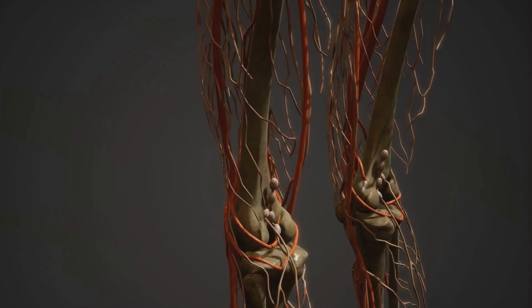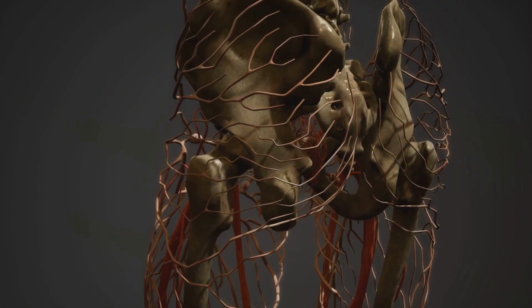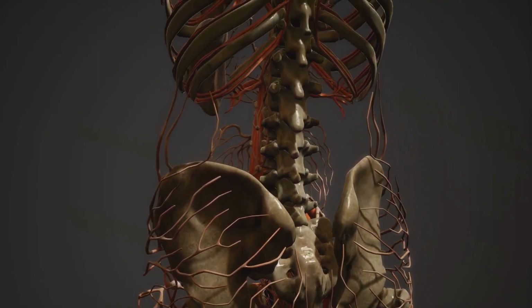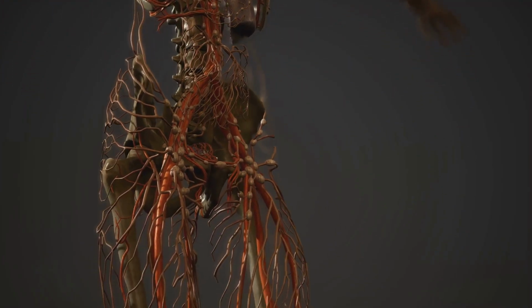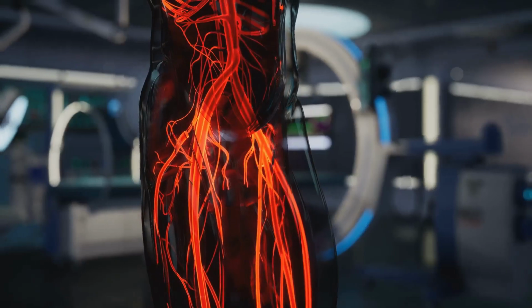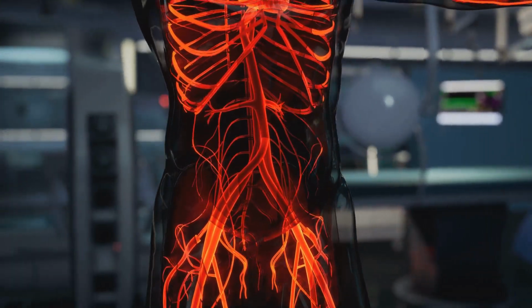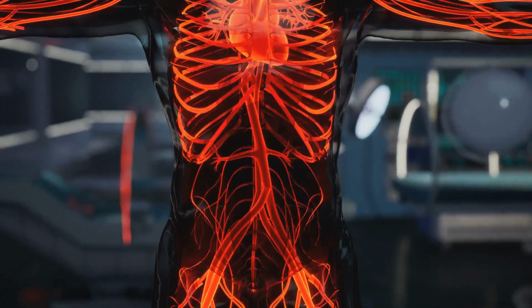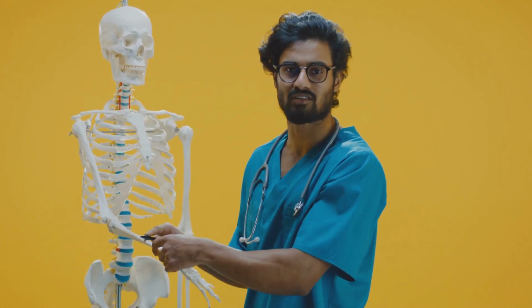Last but not least, we have the carotid artery. It's a major blood vessel that supplies oxygenated blood to the head and neck. It runs parallel to the internal jugular vein, but it's usually palpable and has a robust pulsation. It's extremely important to differentiate between the carotid artery and the jugular vein, as unintentional puncture of the artery can lead to serious complications. Now, why is it so crucial to accurately identify these landmarks?